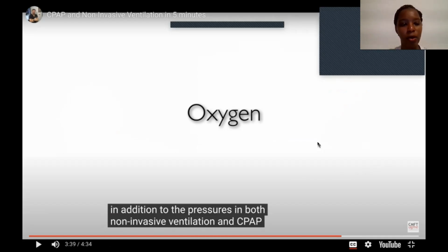So that is when you set on the ventilator, you'll always notice that when you see the curve, the one that was being drawn there, it never drops below what you have set as the PEEP. So any pressure you set as the inspiratory pressure, like that 15, is pressure above this CPAP pressure. That will be the total inspiratory pressure for this patient. So that is very important, even when you're looking at the curves.